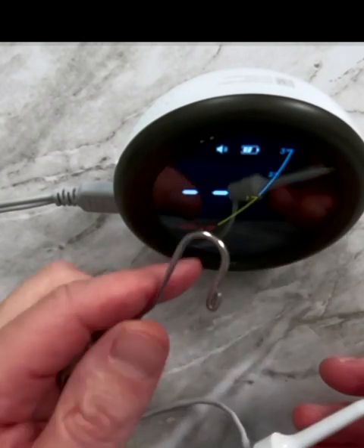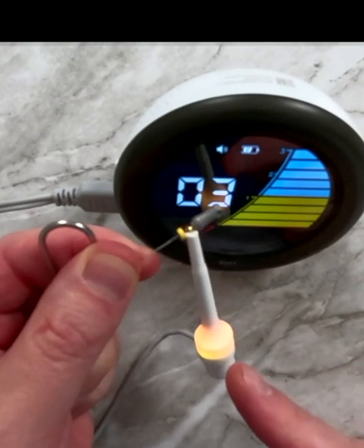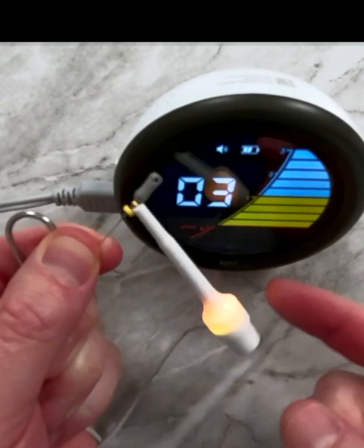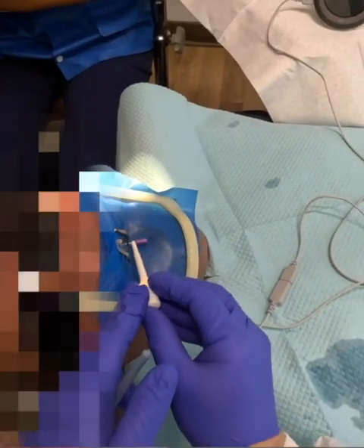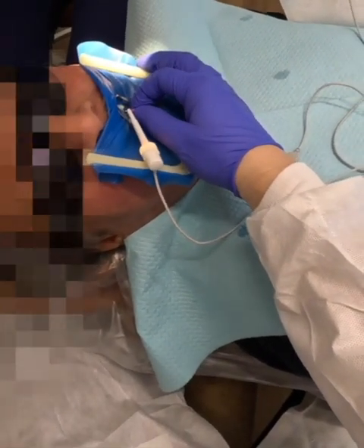Apex Locator. This is the Apex Connect, and what's really cool is that you actually get light up on the file clip. This corresponds directly to what you're seeing on the display. So as I progress down, you'll see that the file clip will start to light up.